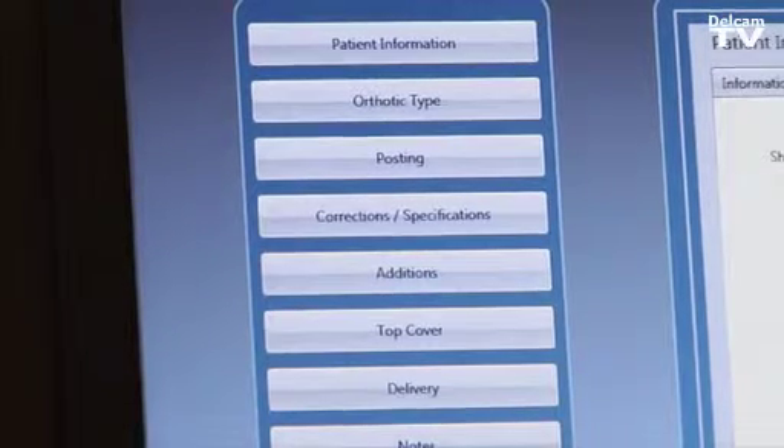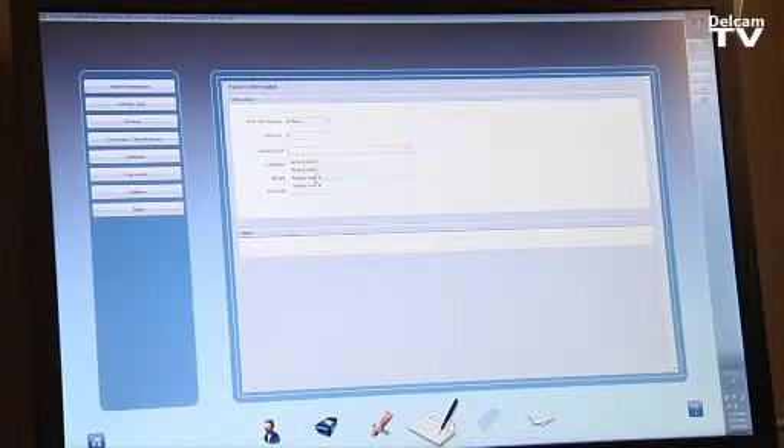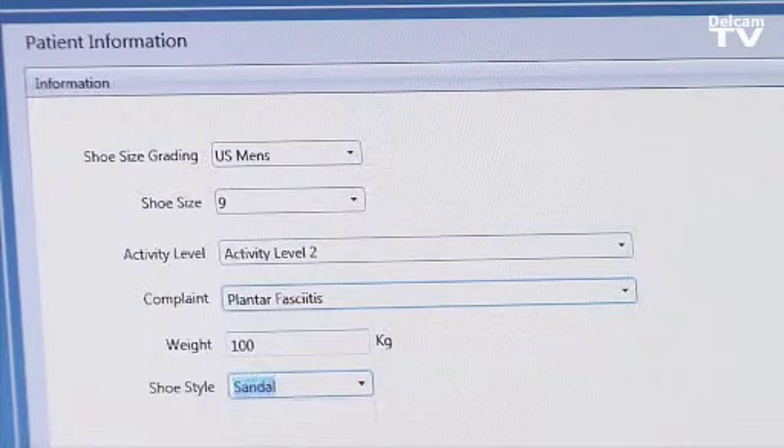On the left-hand side we have all the options we can select — for example, the shoe grading such as US men's size 9, the activity level from 1 to 4 covering rigid, semi-flexible, and flexible, the problems the patient may have such as heel pain, forefoot pain, plantar fasciitis, the patient's weight, and the shoe style depending on the manufacturer we work with.